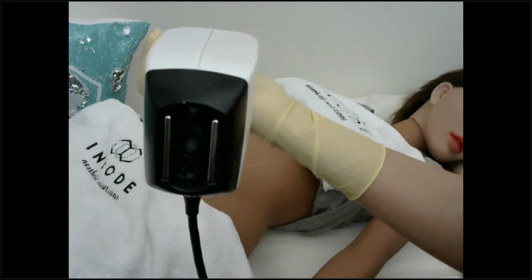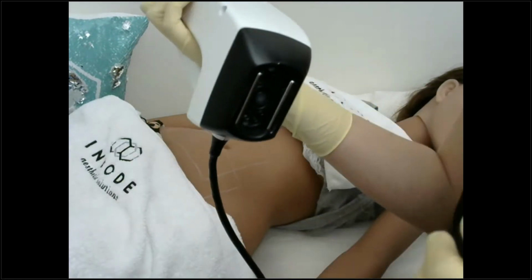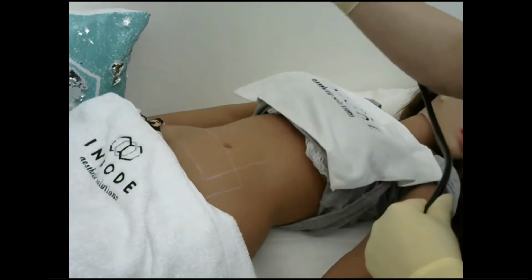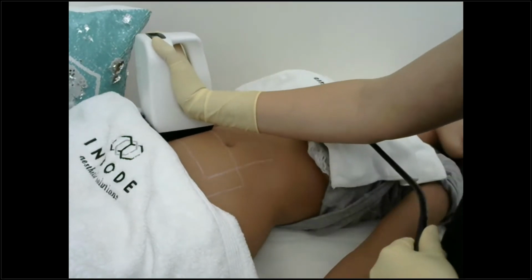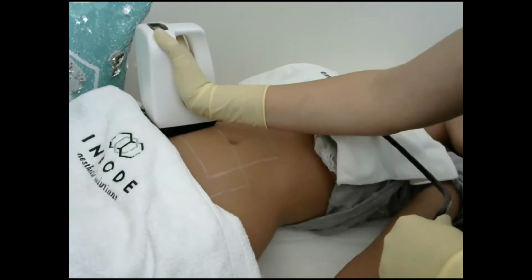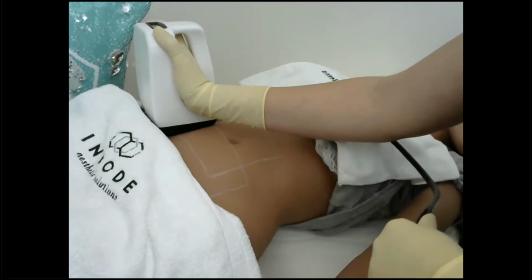So that would not be possible for me to show today, because it's also not possible to show in the arms. It's not fatty enough, so I will not volunteer that unhappy arm that we saw before. So the idea is I'm just going to give 4 seconds pulse. We talked about double pulses on the first 2 passes, just in order to increase the temperature faster.